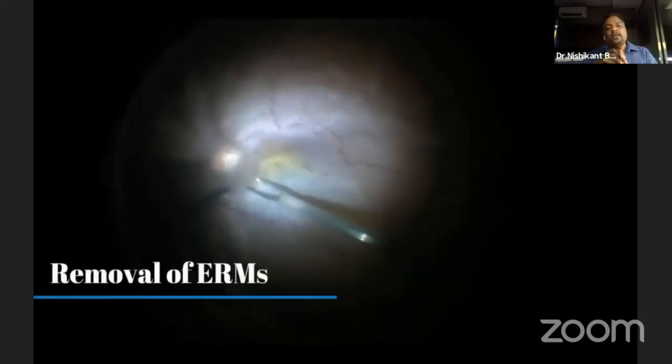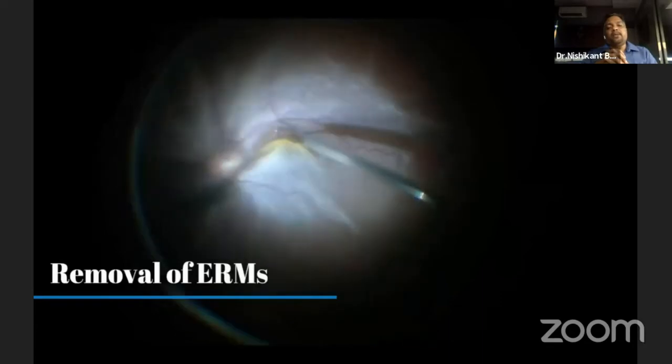Do a good vitrectomy, and remember to do a good vitrectomy before you rush to do your relaxing retinotomies or retinectomies, because a stiff retina gives you like a third hand, and it helps you in vitreous dissection. Remove as many epiretinal membranes as possible. You have to do a very, very meticulous membrane removal, because otherwise post-operatively these membranes start contracting and cause a recurrence of PVR. It can cause retinal contraction, and most of your retina might be settled, but your macula starts getting macular proliferations, and you might have to go in again just to remove that.